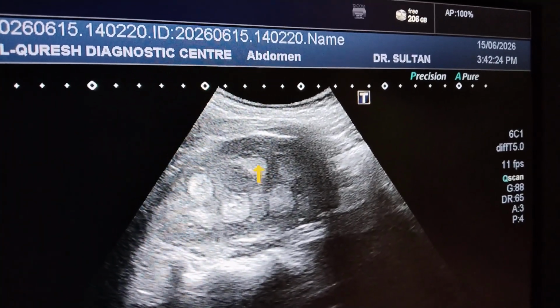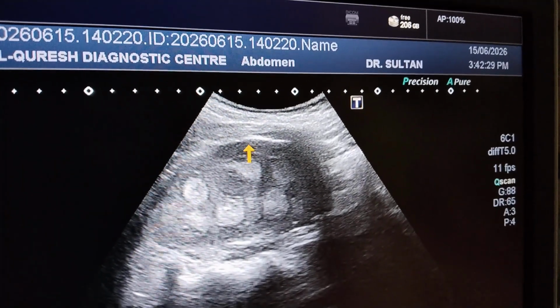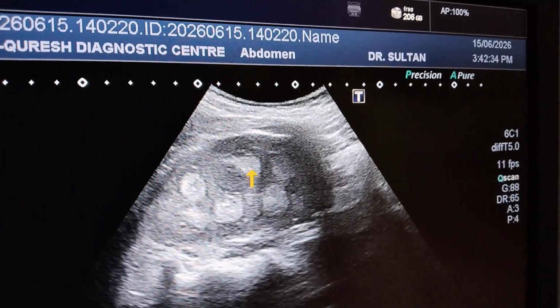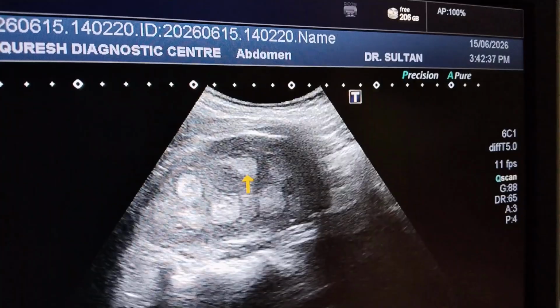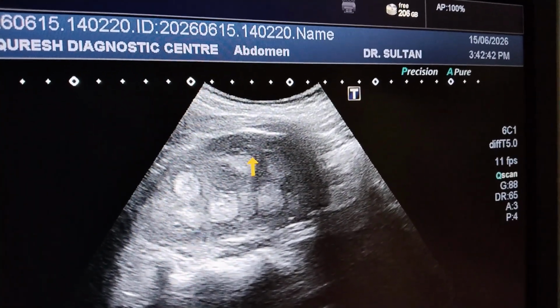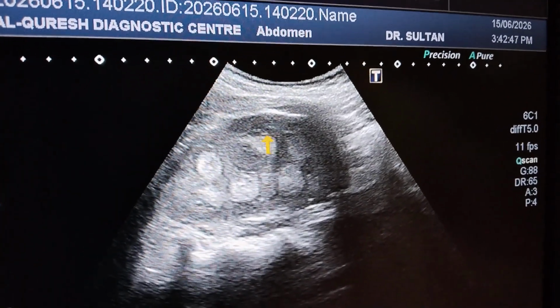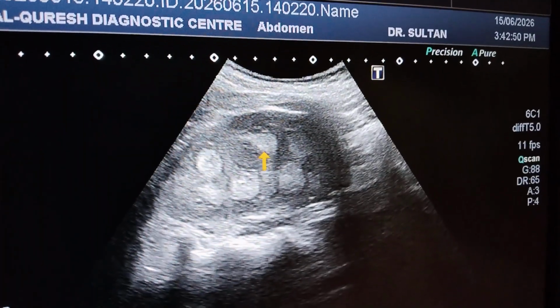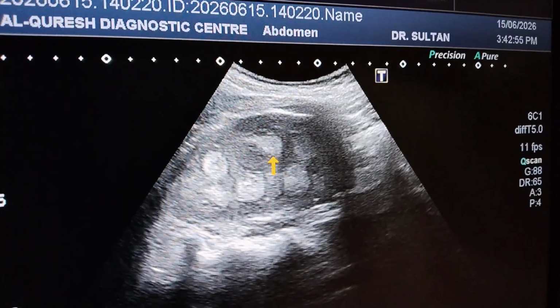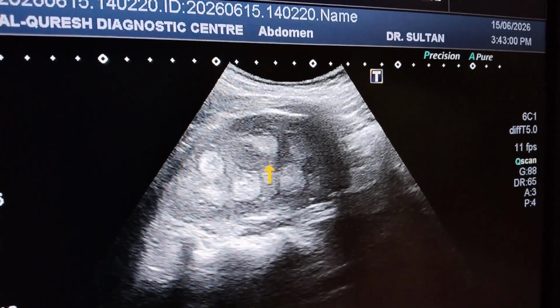Now its function is that urine is formed from the glomeruli, goes to the pyramids, to the medulla. The medulla concentrates it, and this pyramid is triangular in shape. This area is the broader one and this is the conical shape, this is the apex. So this apex has an opening for the calyces.